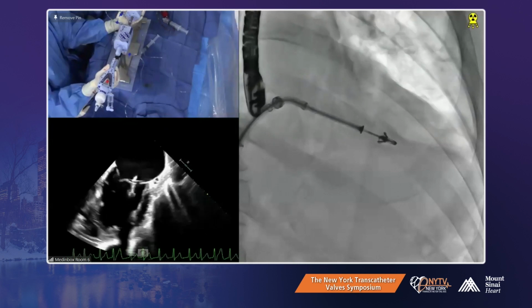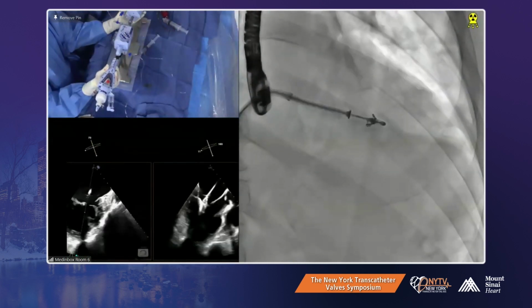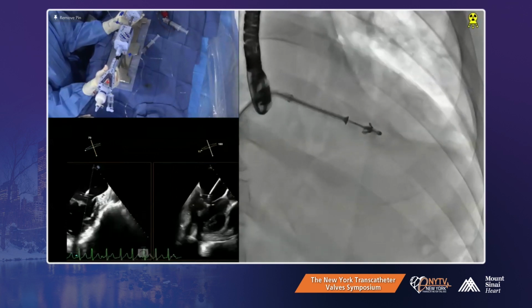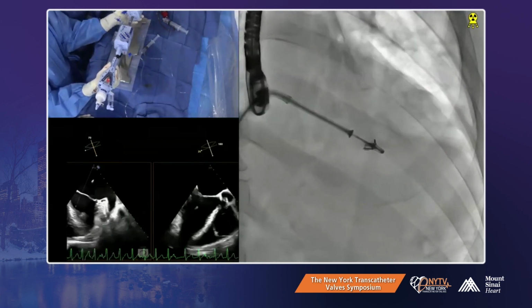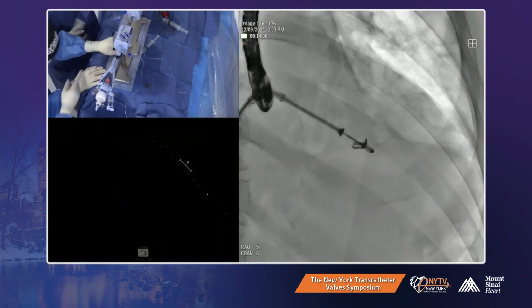We take off M. We had a lot of M off because of the plus, right? So now we're caught. You feel stuck? Yeah, it looks like the shaft is stuck if you look at it here. Okay, now we came. Now we're unstuck. Very close. Can you get us a better BICOM image, please? It's all rotated.